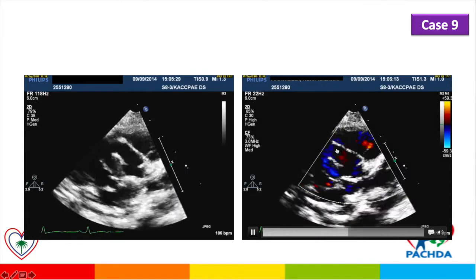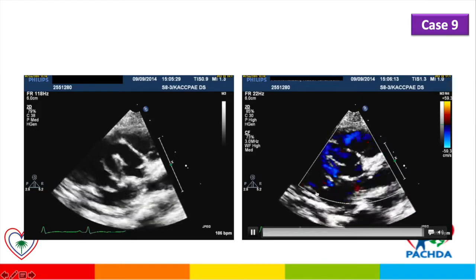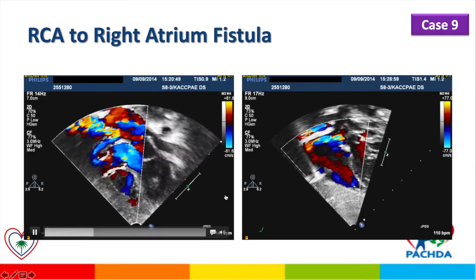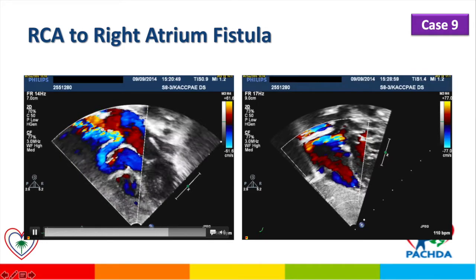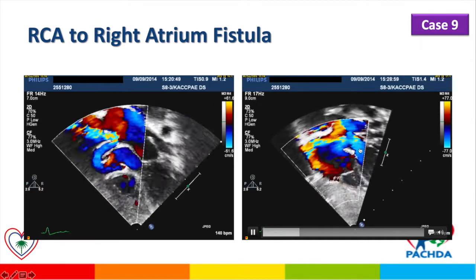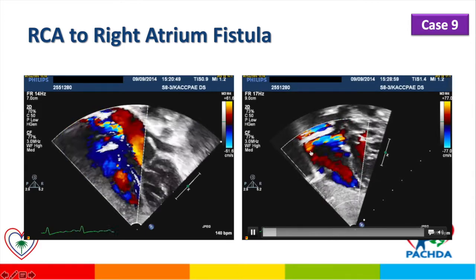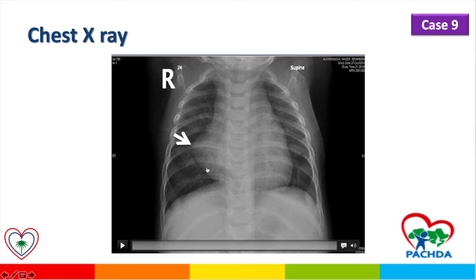With color Doppler, there is severe dilatation of the right coronary artery with turbulence toward the right atrium. The subcostal view shows a huge coronary artery fistula originating from the right coronary artery into the right atrium. With further imaging, the fistula is seen jetting into the dilated right atrium. The chest X-ray of the same patient shows that the right border of the heart is deformed because of the fistula.